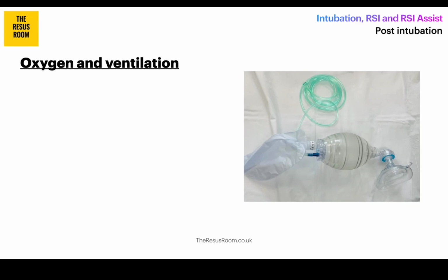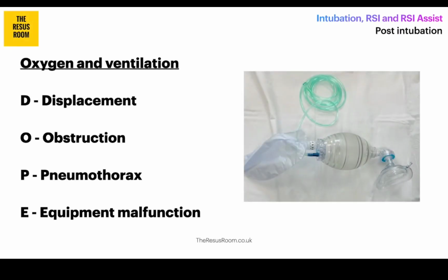And there's a really useful mnemonic out there. So the DOPE mnemonic. So the D, well, that stands for displacement or dislodgement of the tube. O, that stands for obstruction. So thinking about mucus plugs, about blood in the tube, about other secretions that might need suctioning, or the kinking of any tubing.